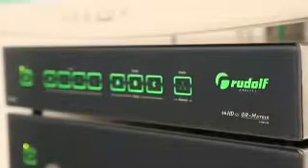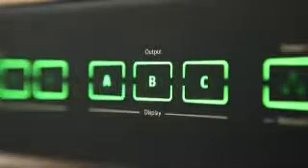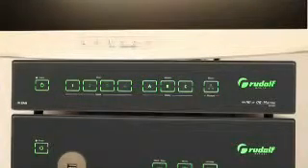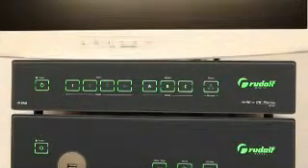The overall system is completed by the 44 HD SDI OR matrix, which expands the system by the functional range of an integrated operating theatre. It allows images to be distributed from one or more operating theatre camera systems to various diagnosis, monitoring or operation monitors operated in parallel or individually, the combined use with documentation systems, and the real-time transmission of the operation via a local area network. In the initial state of the OR matrix, the signal 1 of the endoscopy camera is automatically set to monitors ABC and the stream function is deactivated.